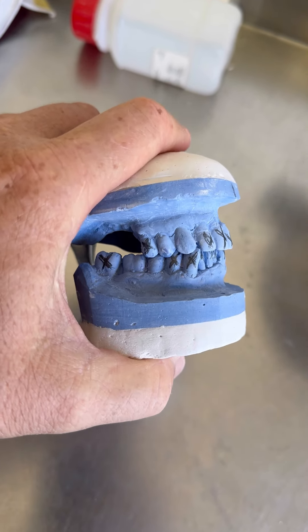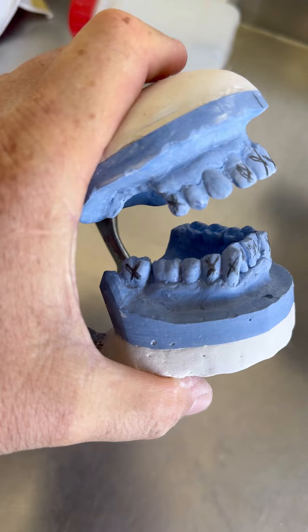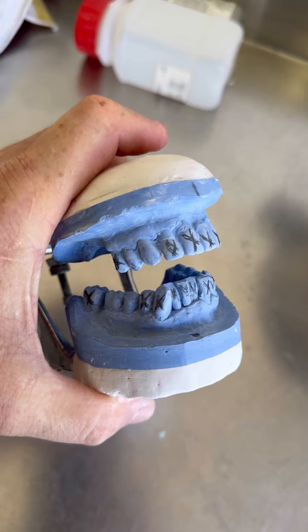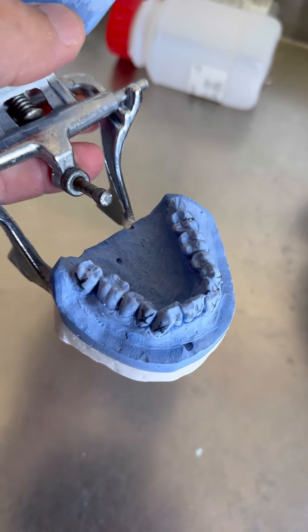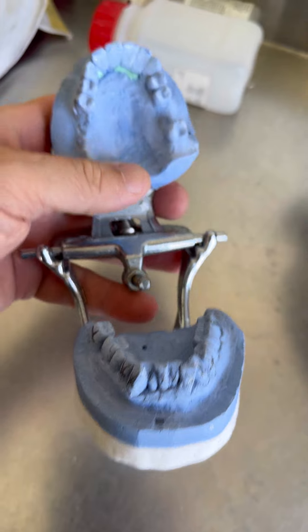Помеченные крестом — им всё. Их точнее доктор удаляет, а я их удаляю в данном случае для того, чтобы сделать на их место протез. История простая: пародонтоз съел все зубы, поэтому доктор решает их удалять.